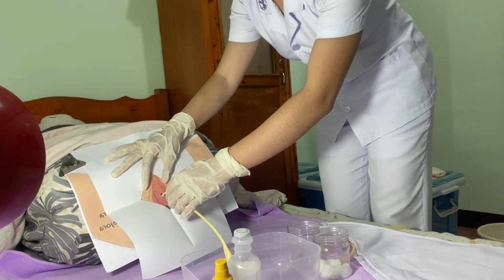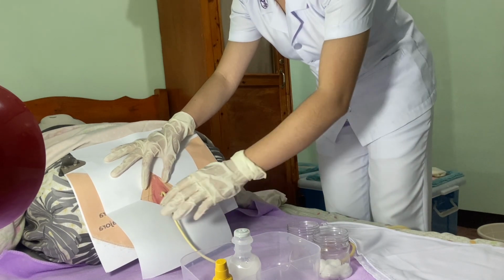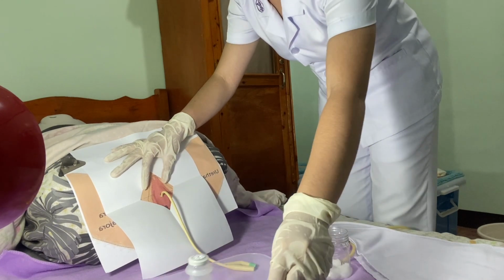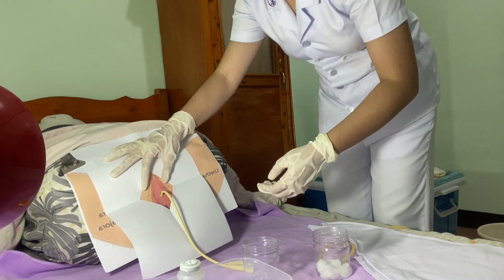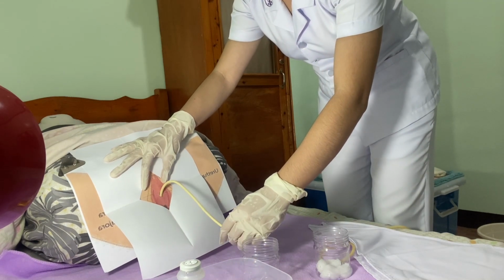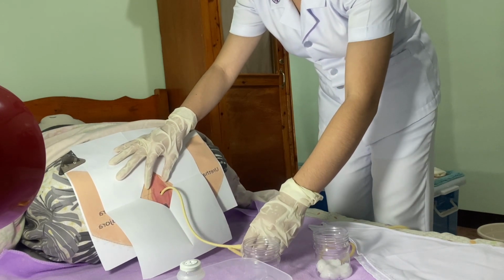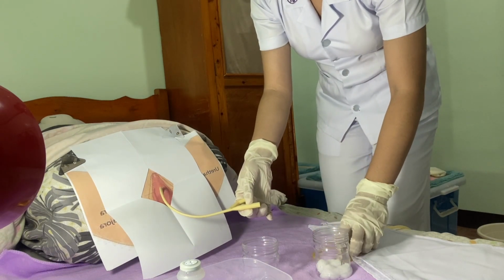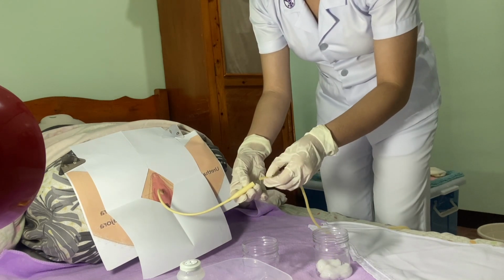If a specimen is to be collected, pinch the catheter, because the urine will flow out if the lumen is not occluded. And we have to place a container in place. So we have to rest our hand on the pubis area while holding the catheter in place to prevent pulling or pushing the catheter. So now I'm going to connect the catheter with the urinary bag, making sure that the urine bag is closed to avoid leakage and maintain the sterility of the connection.